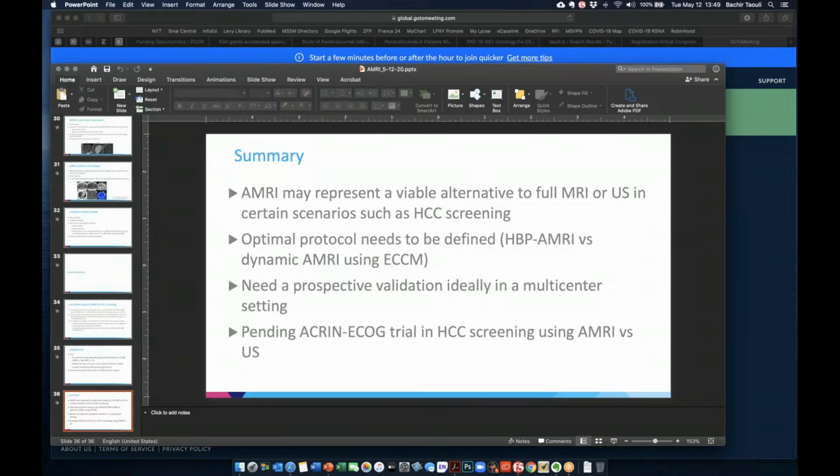Okay. Along a similar note, it's great if a patient can complete the entire MRI examination, but sometimes even in the beginning you know this is not going to go well. This patient may be able to be in the scanner for 15 or 20 minutes maximum, and is it acceptable to do an abbreviated protocol, knowing that you're not going to get the entire study, and then apply LI-RADS to it? I mean by actually getting the dynamic sequence, at least, not just the hepatobiliary phase after. Is it okay to apply LI-RADS and get a LI-RADS category if you think the study is adequate, like you have your key components?